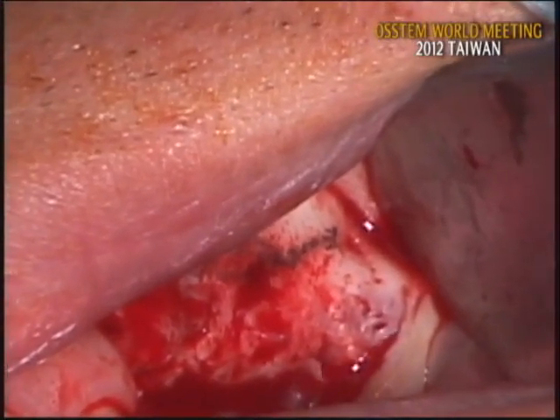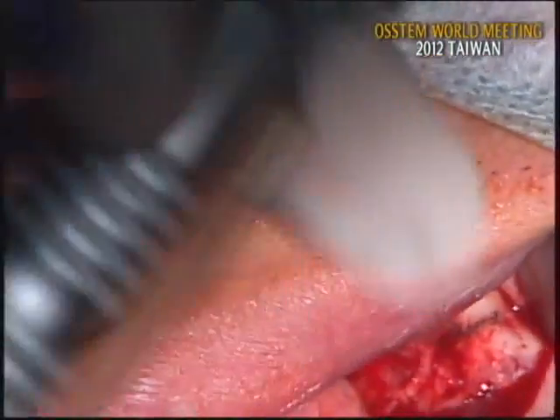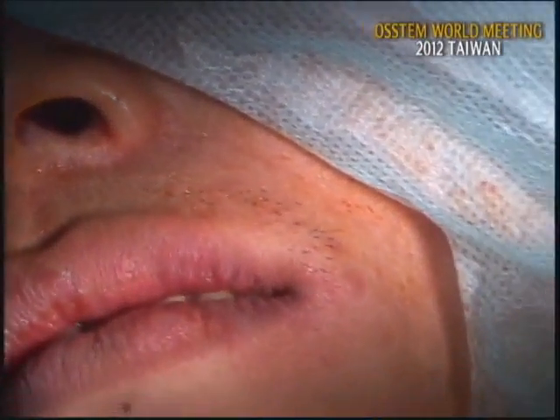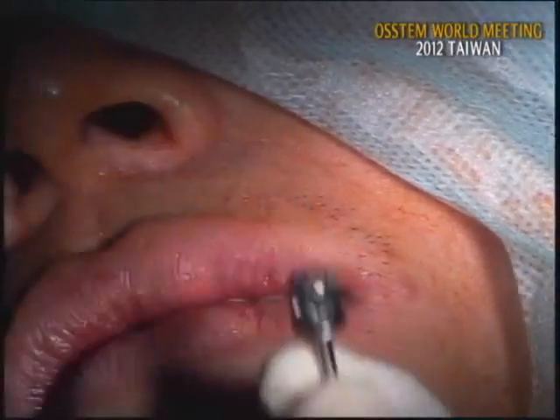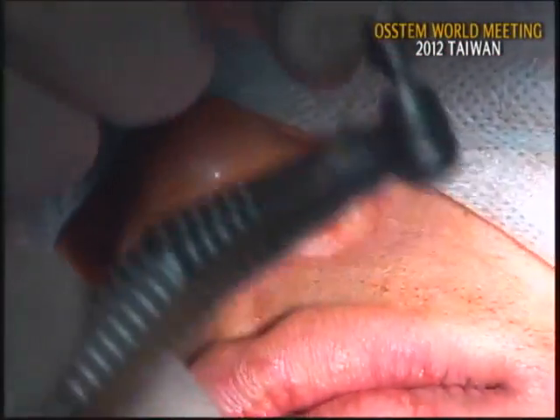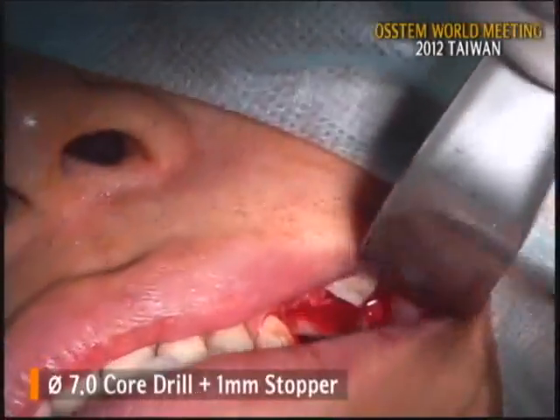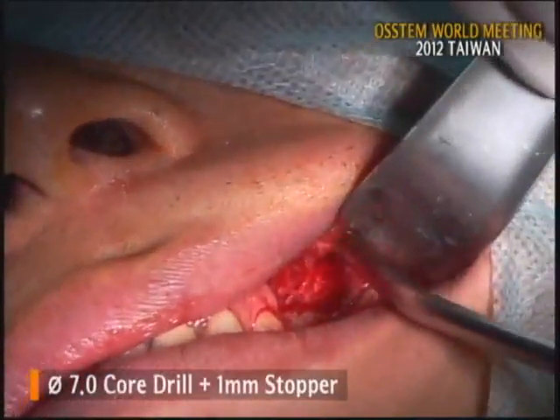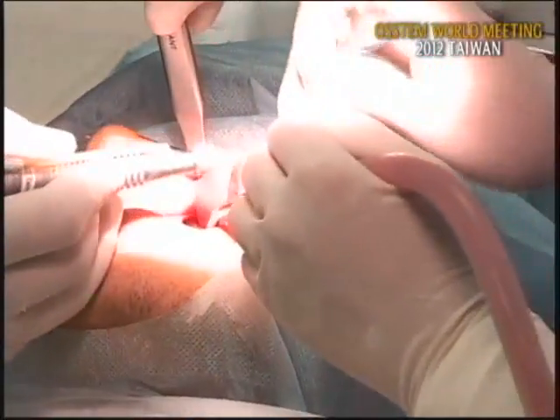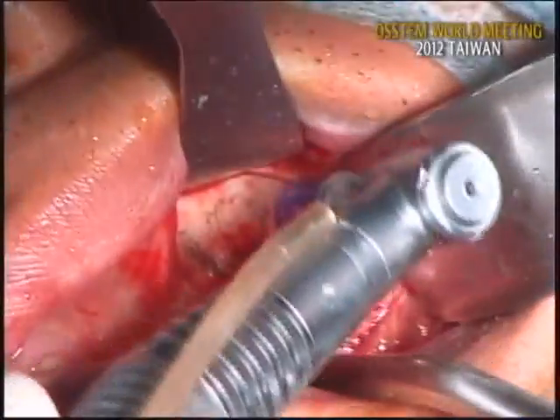Here I prepared the LAS-KIT. This is the 7mm core drill, not the dome drill, and I connected the 1mm stopper. Okay, and the speed is high RPM. Okay, like this. All right, let's try. Here.